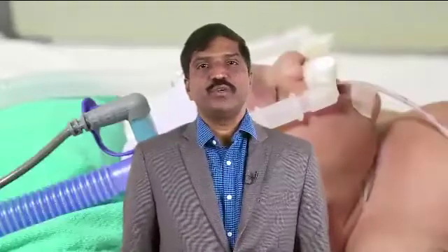Any baby who continues to have moderate to severe recessions, grunt, saturation less than 90%, has recurrent apneas even on maximum CPAP settings of pressures of 7 centimeters and FiO2 of 60% or more is a candidate for mechanical ventilation. This is considered as CPAP failure. Always assess for appropriate delivery of all the components of CPAP before labeling CPAP failure. Those newborns who do not have good respiratory efforts and those not tolerating CPAP machine may also need mechanical ventilation. The commonest reasons for CPAP failure or need for mechanical ventilation are the failure of CPAP delivery system or baby related events such as worsening respiratory distress, cardiovascular instability or recurrent apneas.